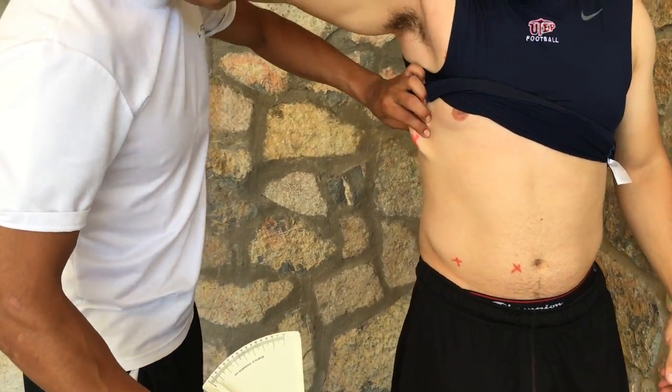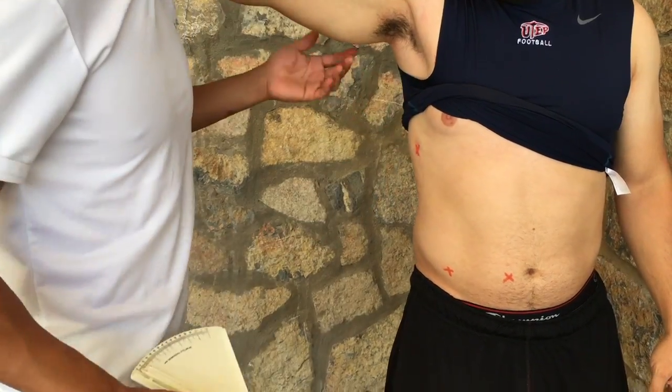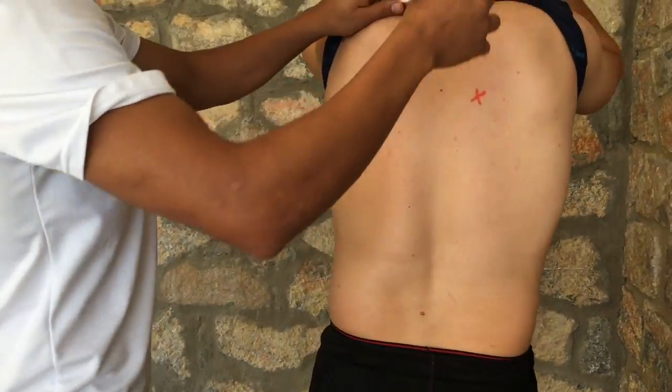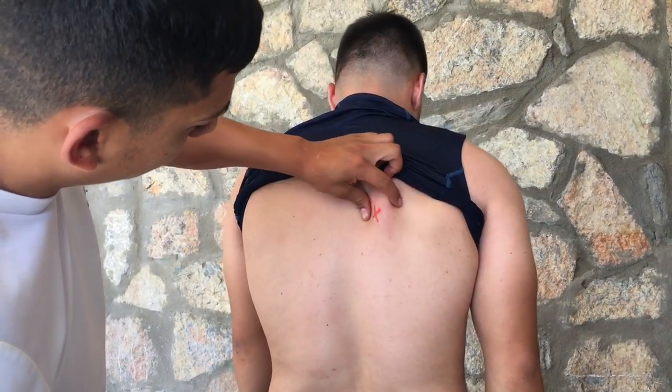The mid-axillary site is a vertical fold measurement. The subscapular site is a diagonal fold at a 45-degree angle.